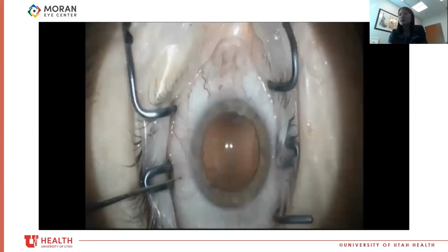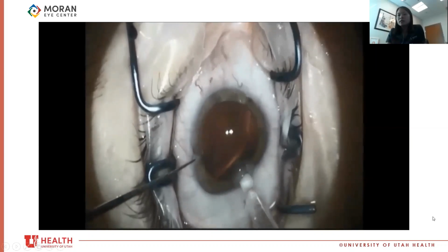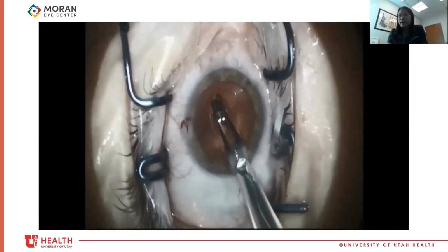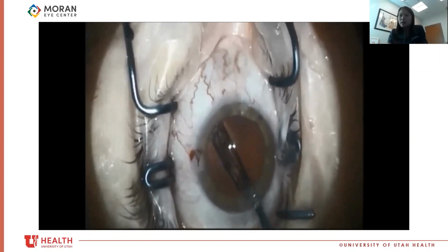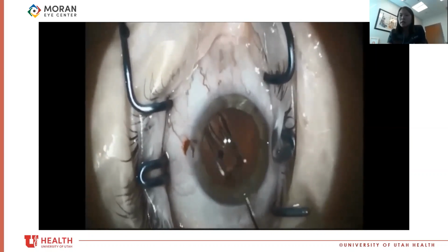So this is cataract surgery that I did probably about 5 years ago now. And it has so far been quite uneventful. I'm going to be putting in the IOL. And this is just a standard single piece acrylic ZC blue lens going in. Happy that the case is going to be done in a few minutes. And the IOL goes in, it's starting to unfold. I tuck it into the bag. Things are great.